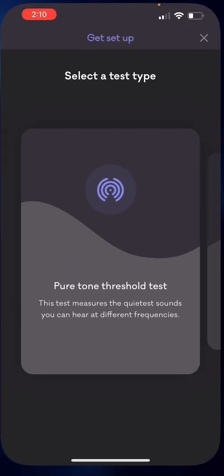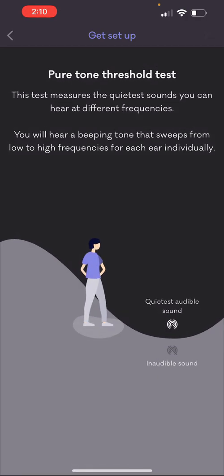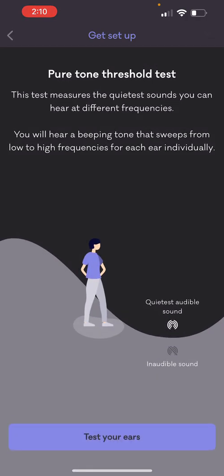You're going to open it and choose the Pure Tone Threshold Test. You're going to take the test, and once that's done, you're going to export the file that it gives you at the end.